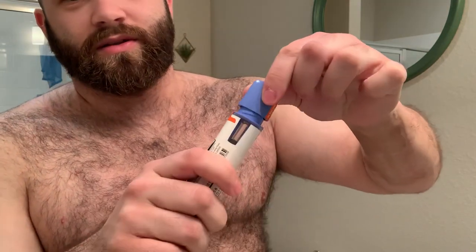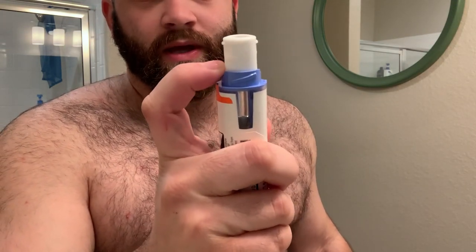I'm going to try and do it a little higher than you would think, to let you guys be able to see it. So you just need to break the seal — you do this, open it up. There's the needle — you can see it. It goes right inside of there, and this piece gets pushed down against you. Then the needle goes inside.